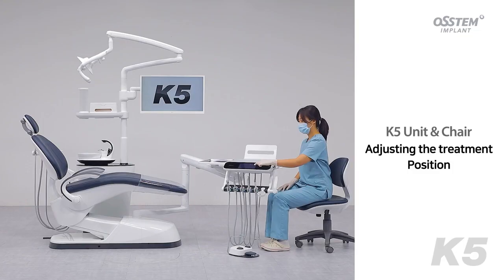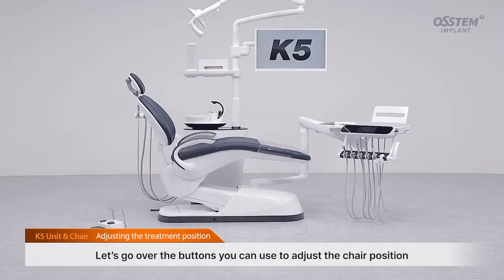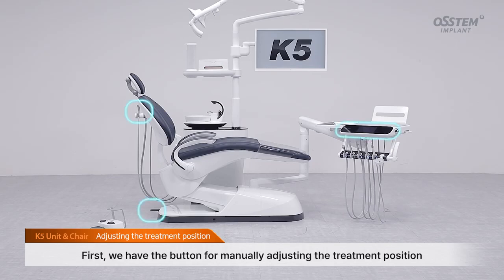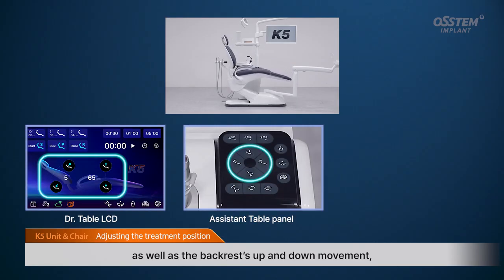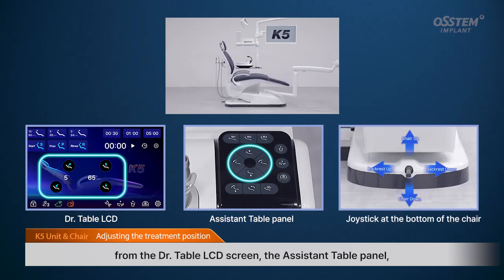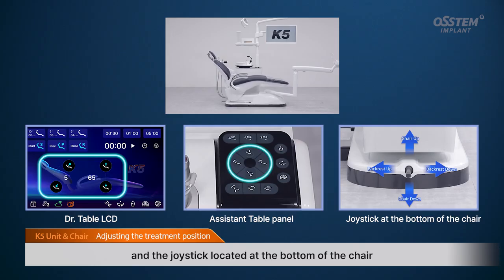Adjusting the treatment position. Let's go over the buttons you can use to adjust the chair position. First, we have the button for manually adjusting the treatment position. You can control the chair's up and down movement, as well as the backrest's up and down movement, from the doctor table LCD screen, the assistant table panel, and the joystick located at the bottom of the chair.